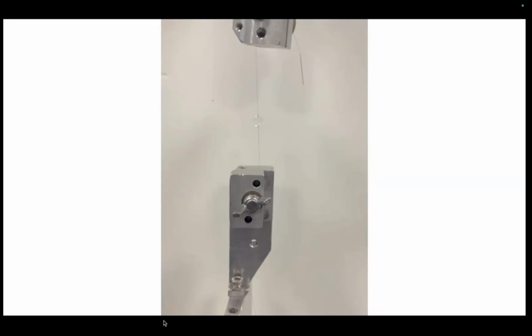The one good advantage of this procedure is that it is well tolerated. Mild decentration, mild tilt is very well tolerated because you are positioning the IOL posteriorly, which is closer to the nodal point. So all these things are well tolerated and we have very good post-operative visual results. When you are choosing the intraocular lens, always choose an IOL power which is 0.5 diopters more than what is there in your biometry. If it is a myopic patient, I will increase the IOL power by 1 diopter.